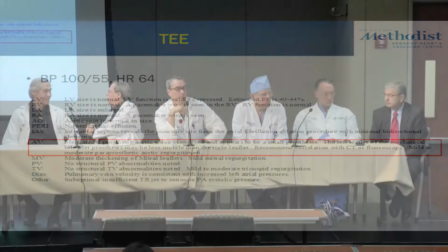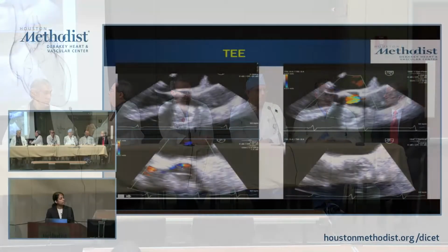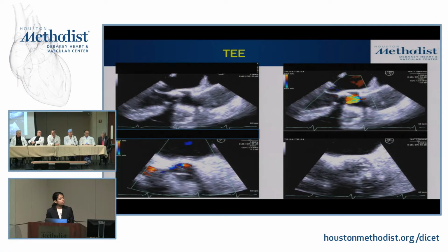My question would be how confident are we that this is paravalvular? I mean, I see the little jet on the short axis view. I didn't see that it was outside the surgical ring. It's asymmetric, but if you have one of the two leaflets that isn't closing properly or opening properly, that can give you an eccentric jet. So far, I'm not sure, and we've dealt with this clinically quite often when you're considering plugging and fixing things. It's not trivial to figure out sometimes whether it's actually paravalvular or not. So finding a hole outside would be useful. So if there were an imaging modality that could do that, that might be helpful.